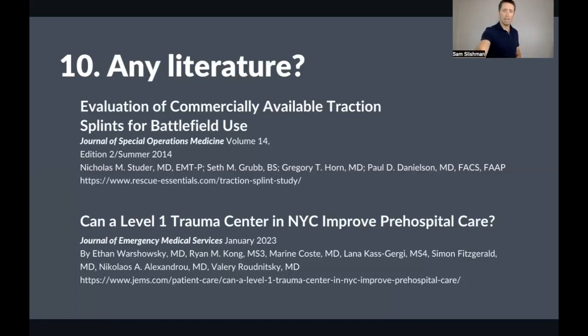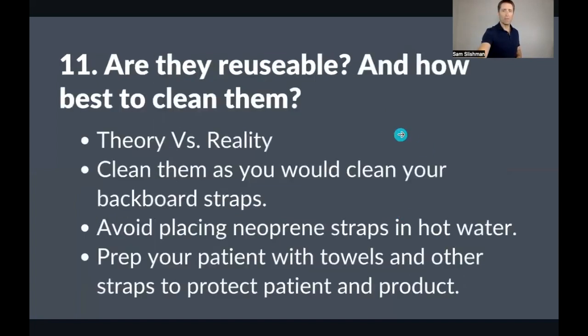All right, are they reusable and how best to clean them? There is theory versus reality. The vast majority of traction splints find themselves in emergency rooms or ambulances, and they never see a patient. They sit there at the ready, like AEDs.